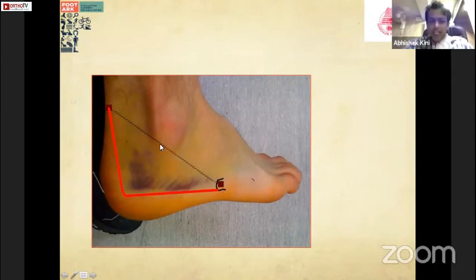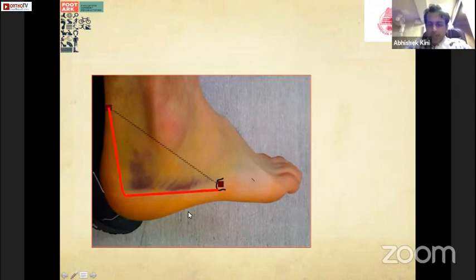From this end, the line that crosses or extends up to the tendoachilles is where I will extend my incision. So this is my landmark. I avoid going through all these ecchymosis areas, and I am slightly posterior and inferior to these lines.